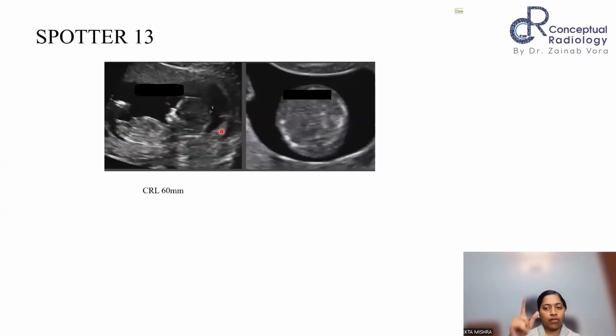Okay. Now another interesting question. So it's a mixed bag, easy and little dicey cases. So NT-NB scan again. CRL is 60 mm. I see some NB, but this is not the view. We can do better. This is a section where I was trying to take abdominal circumference. One structure is missing in this. If you name that structure, the diagnosis will strike you.